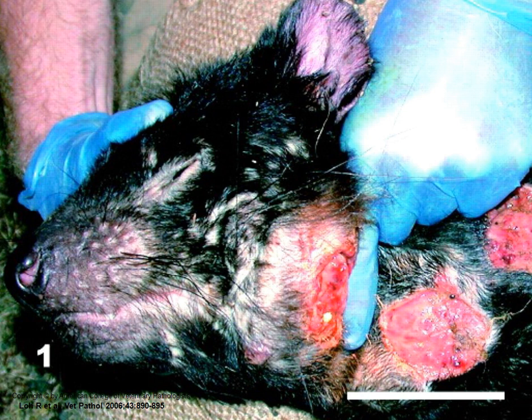And now I have received some PowerPoint images from Davis, as well as some excellent histologic material, which I would like to comment about. I guess we should always talk about the gross and in vivo features first. You can see this is a Tasmanian devil. Here's the ear. You can see there's the closed eye, nose, mouth. And in the neck region here, you can see that there are some ulcerated nodules. I believe these are probably naturally ulcerated because of the irregular margins rather than cut margins.